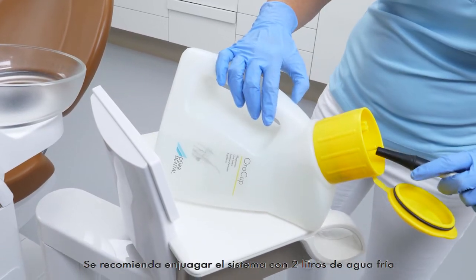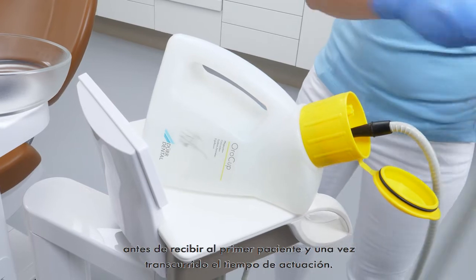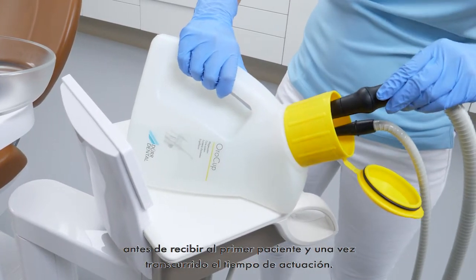We recommend rinsing the system with 2 litres of cold water prior to the first patient and following the expiry of the exposure time.